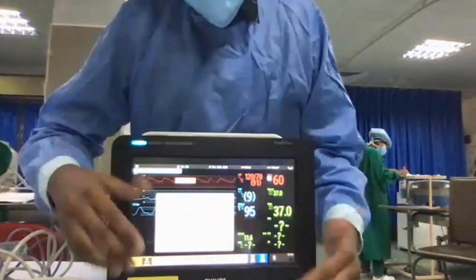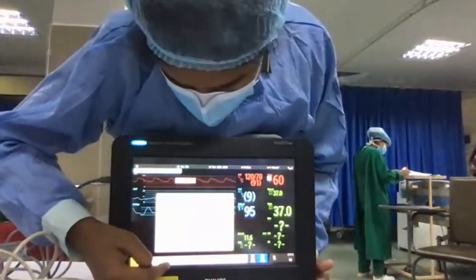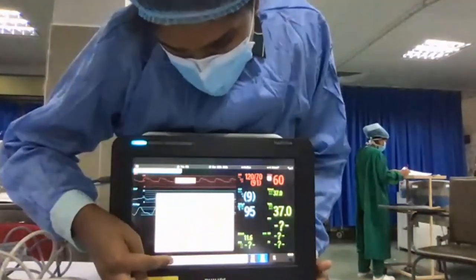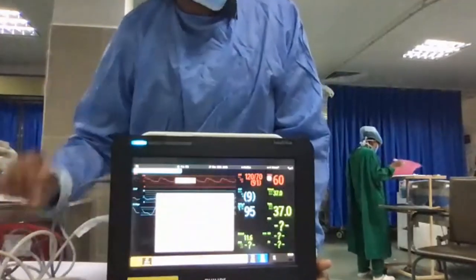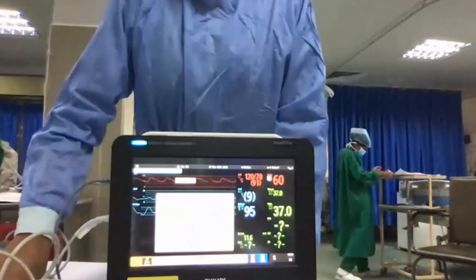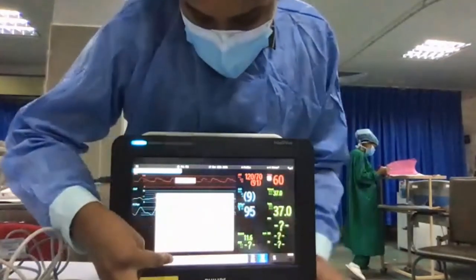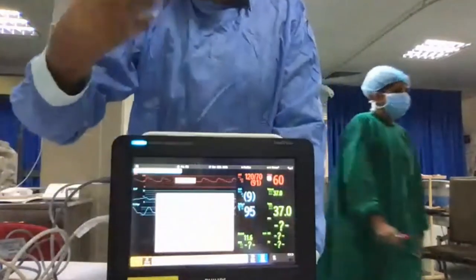So what you can do is a spot calibration, madam. To do that, you can perform calibration. It will resample the vitals and show you a more accurate reading. So it is like a fresh one. Yes, madam. Because sometimes this can change. If you do a spot check, it will update the parameters.